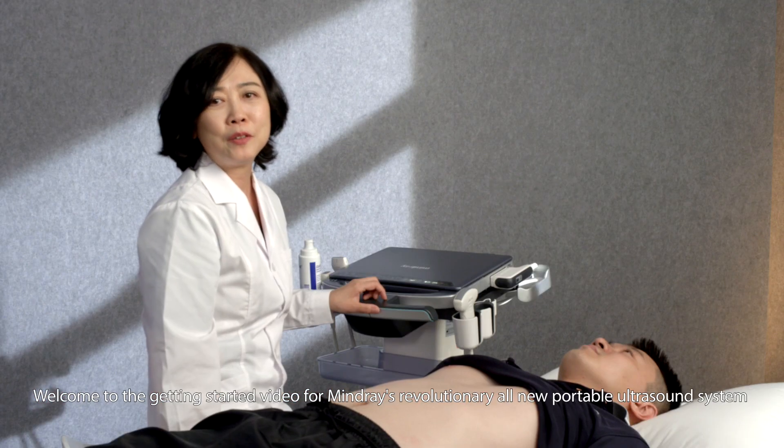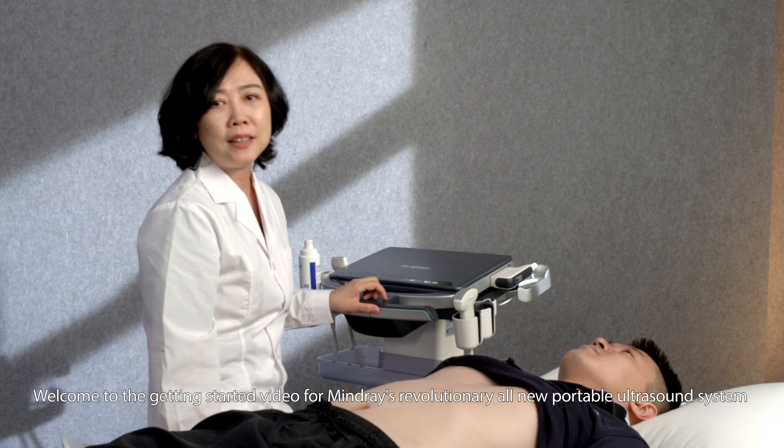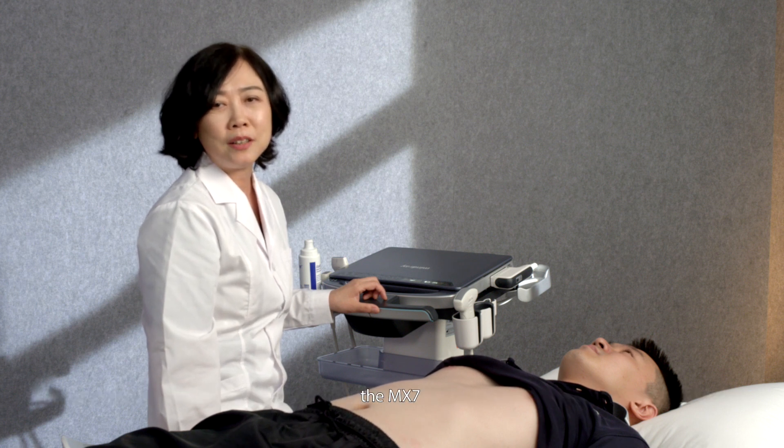Welcome to the Getting Started video for Mindray's revolutionary all-new portable ultrasound system, the MX-7.